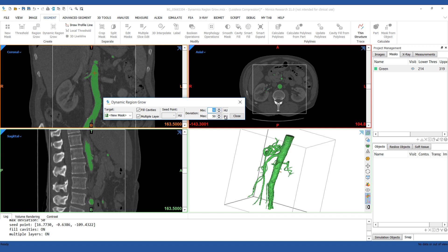If you want, you can also hold down the control key and left click to place multiple seed points. This may be necessary if it didn't capture the vessel you need with your first seed point.